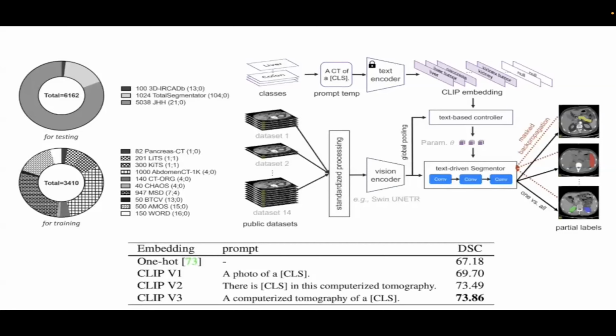So in terms of the model implementation, the universal model that is presented here is trained with the AdamW optimizer with a warm-up cosine scheduler of 50 epochs. The segmentation experiments done here use a batch size of 6 per GPU and a patch size of 96 times 96 times 96.